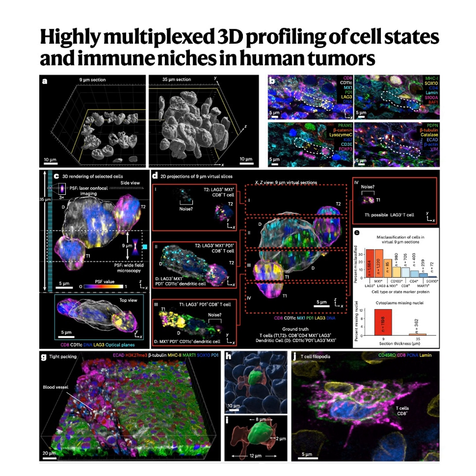And the error gets even worse. It's compounded when we look at specific types of proteins. The study found really huge discrepancies, particularly for what are called polarized proteins. Polarized proteins. What does that mean exactly? So these are proteins that aren't just spread evenly throughout the cell, like, say, paint on a wall. Instead, they're clustered in specific locations, often in tiny spots called puncta, maybe on one specific side of the cell, or concentrated right at the cell membrane where it touches another cell. Think of immune checkpoints, like LAG3, which they studied. Okay, so I'm picturing this cell like a complex building, and the polarized protein isn't everywhere.